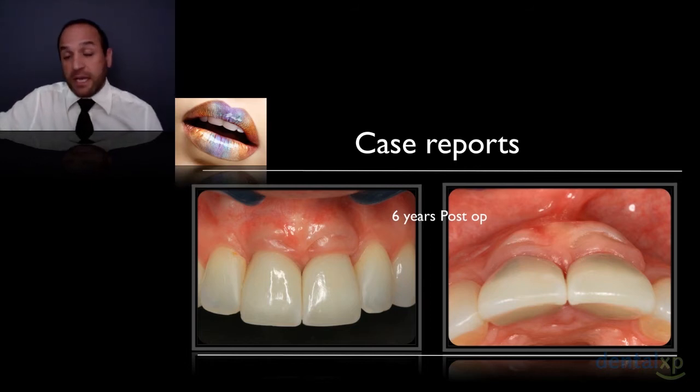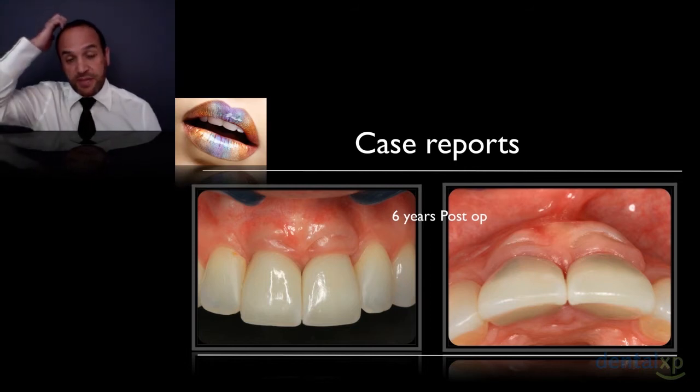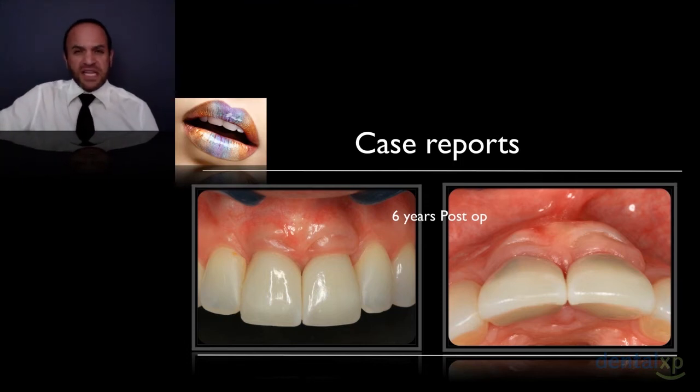My thoughts were, do I come here and do some laser rehabilitation and make it look a little bit prettier? But the fact that I've got such thick soft tissue here, I'm actually more inclined just to leave it. The patient's happy, and just for me to get better photos, just so that I've got to do laser just to get better photos, is maybe not the right way to go. So we did manage to rehabilitate it, but this is the kind of problem that we might be dealing with, and that you might be dealing with when you have these type of cases.